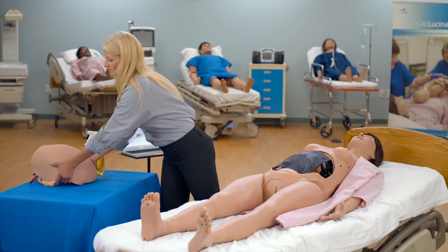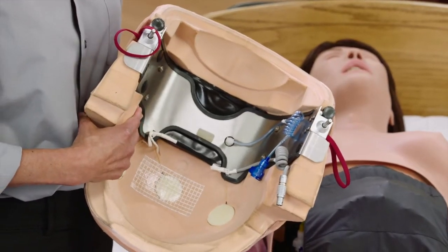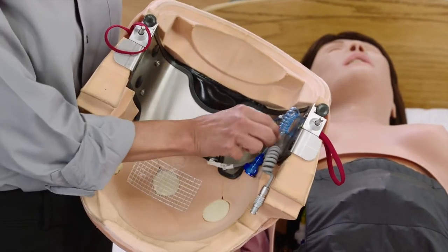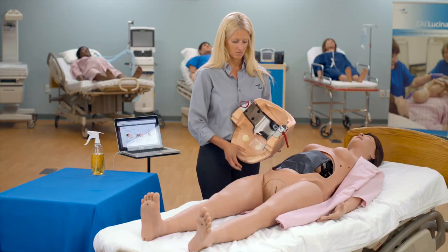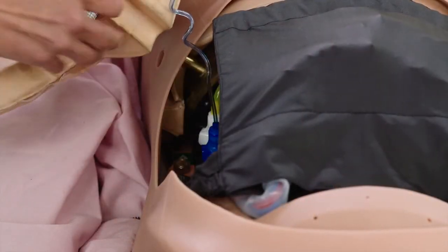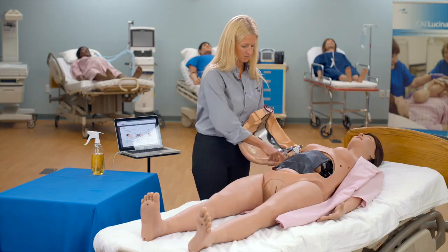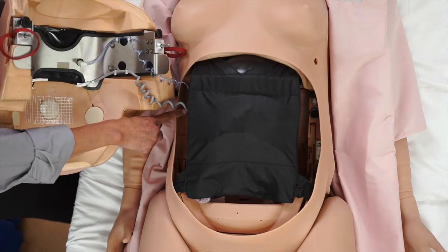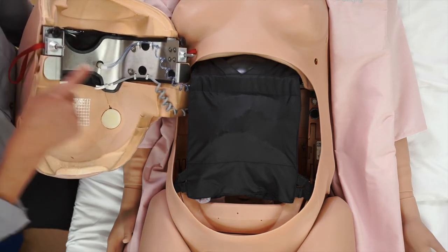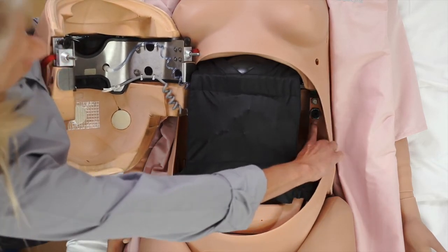To install the delivery abdomen, locate the speaker system cable and the palpable contraction system cord inside the abdomen shell. Plug the cables into the corresponding connections inside the mannequin's torso. Latch the abdomen shell into the mannequin's torso by aligning the latch posts with the mannequin's torso holes, and ensure the speaker cable is not pinched or constricted.